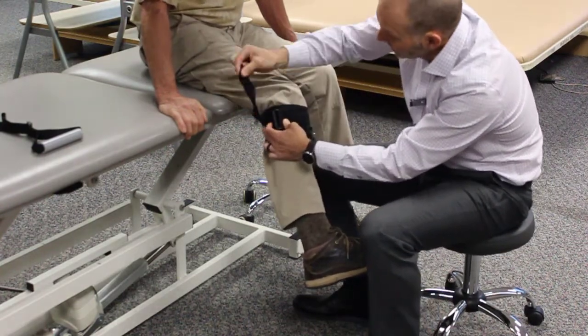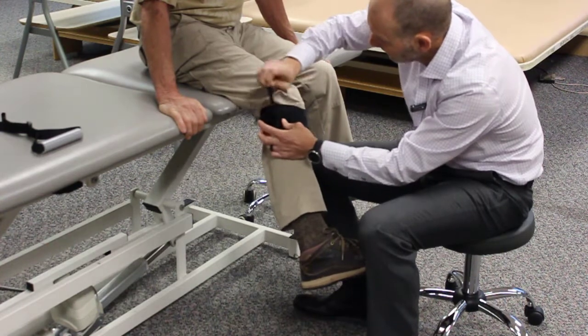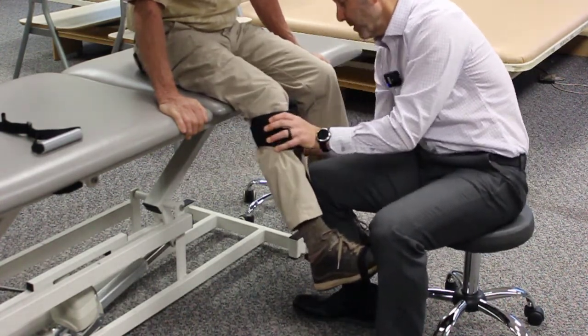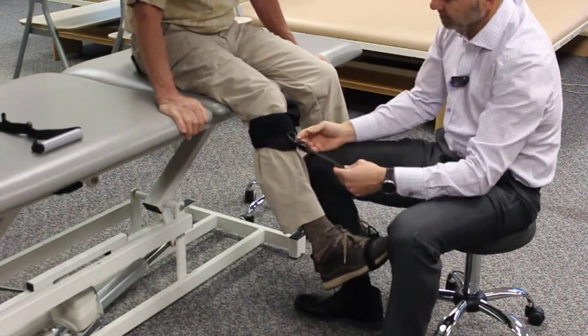Mainly we just need to make sure the strap gets above the calf so it doesn't slip down. This does not need to be real tight. We're not trying to restrict circulation in any way. Just snug enough so that it can't slip over the calf.